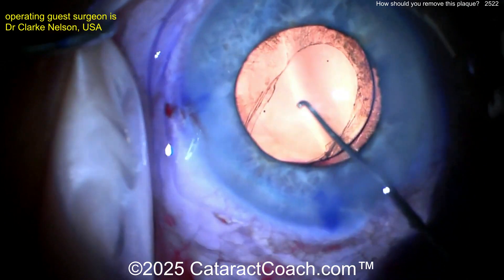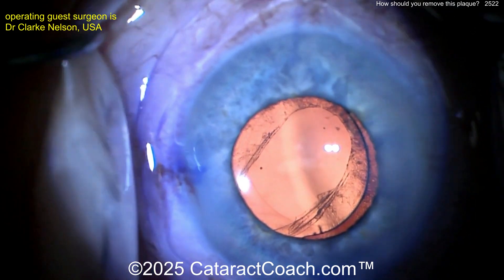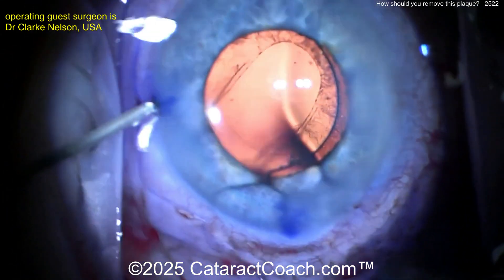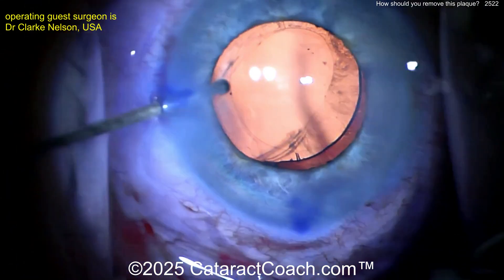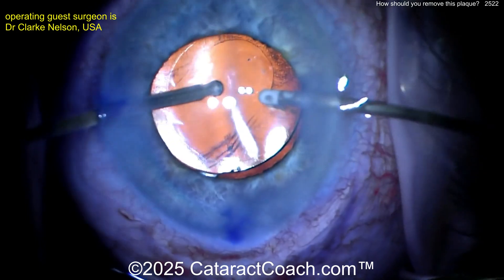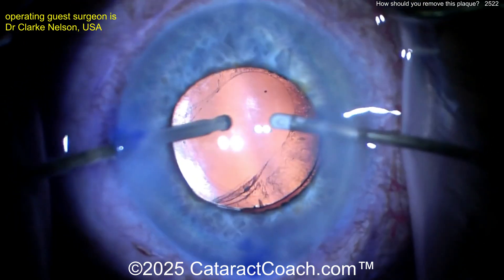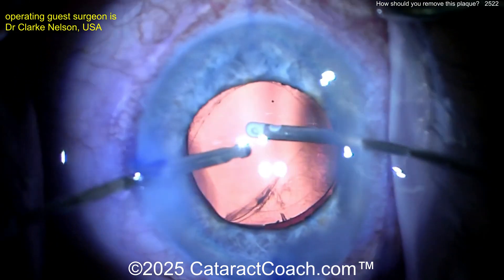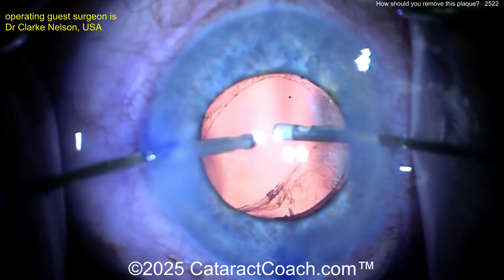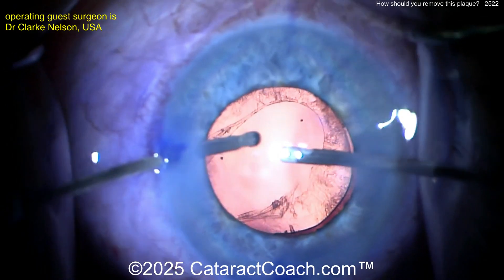At this point, what do you do? Leave it alone. Right now there's plenty of support — it'll be fine. And remember the good news: this patient doesn't need a YAG laser capsulotomy later. So at this point, I agree — leave it alone. Be gentle on the IA to remove the viscoelastic. Very little flow. Drop the flow by half, drop the vacuum by half. Take your time here, and as you aspirate this out, be very gentle. Don't put pressure on this — you can rip the bag even more. If you leave a little viscoelastic in the eye, so be it. This is why we've got some Diamox. Any viscoelastic behind the optic has really no consequence — it's just going to float around in the vitreous cavity for a while until it breaks down.